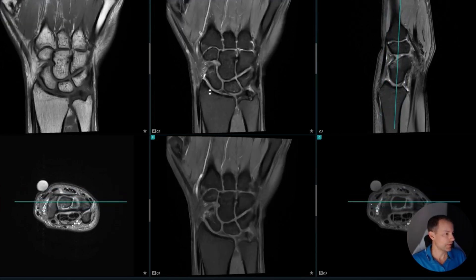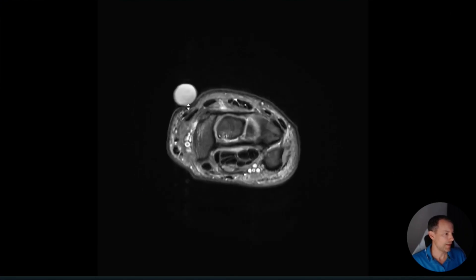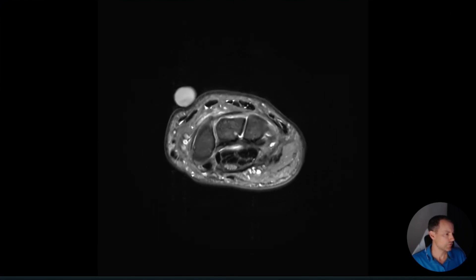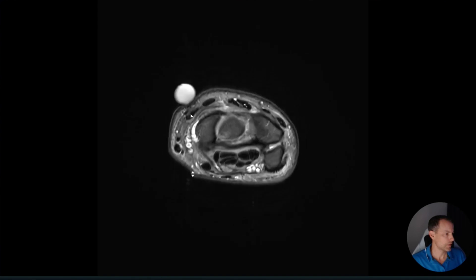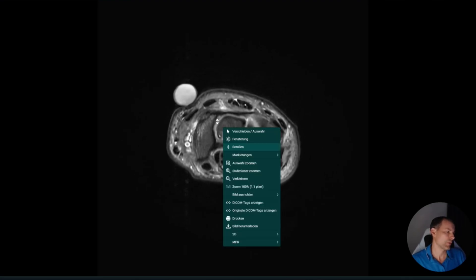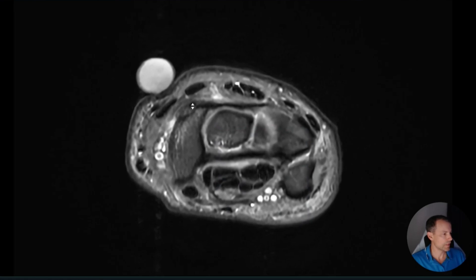We can see the MRI here and the good thing is we have the marker so we know where the pain is. When we scroll through we see some edema there, but we don't really see anything straight from the get-go. This is a nice example of how sometimes contrast can really help. We see there is some faint edema on the dorsal aspect of the scaphoid, and a little bit of a hypertrophic ridge here on the dorsal aspect where the dorsal intercarpal ligament inserts — exactly where the pain point is.